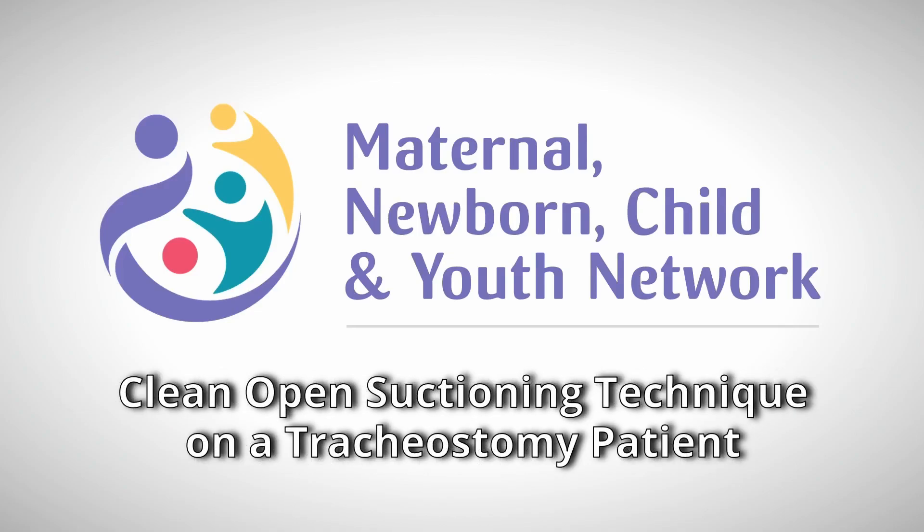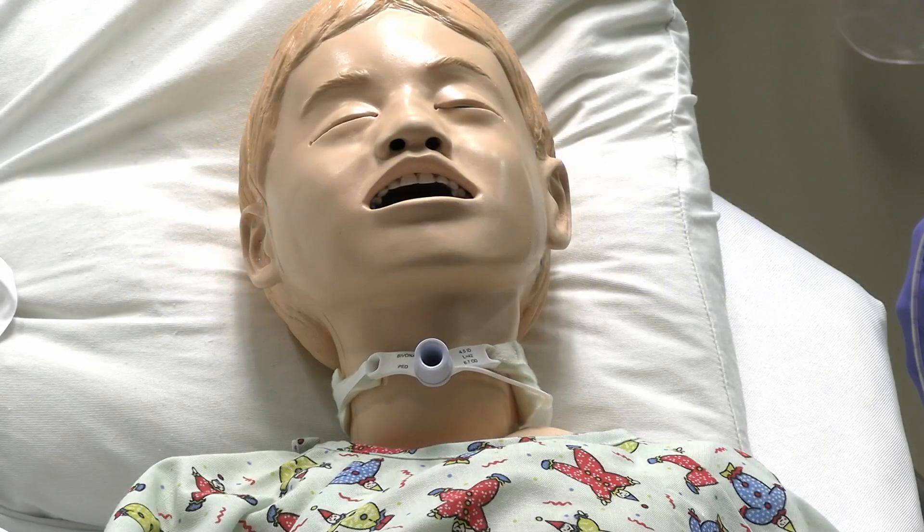Next I want to demonstrate the clean open suctioning technique for a tracheostomy patient. Here we have a pediatric patient that is trached with a 4.5 tracheostomy tube. It is a cuffless tube. All we want to do is help assist with secretion clearance here.